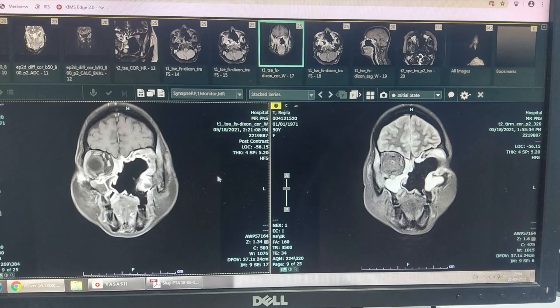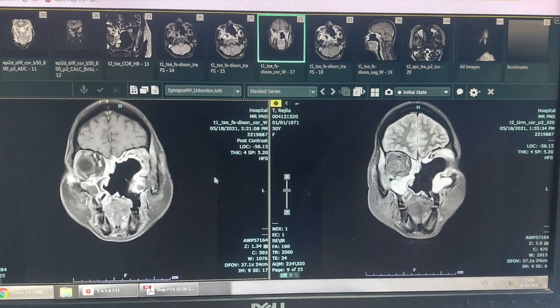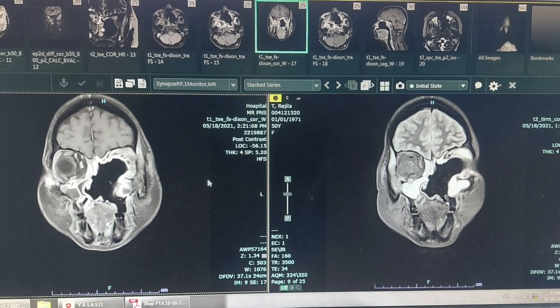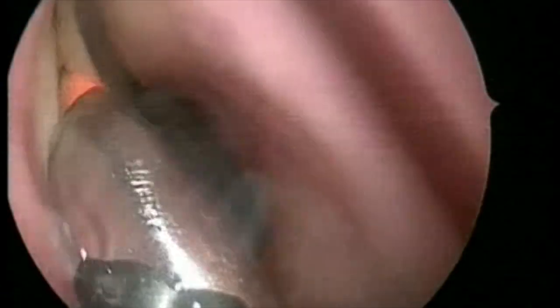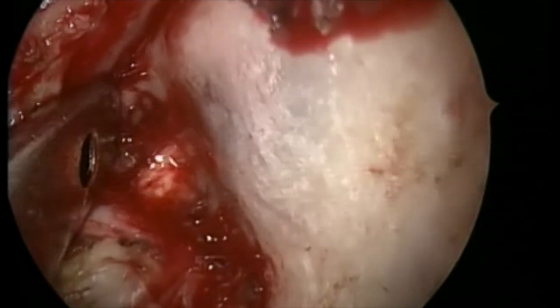Hi, this is Dr. Vinodhs Felix and this is a case of mucormycosis involving both pterygopalatine fossa and the right maxillary sinus, right inferior orbit. We are going to do an orbital clearance on the right side and remove all the necrotic bone on both sides. This patient already underwent left orbital exenteration a couple of months back.